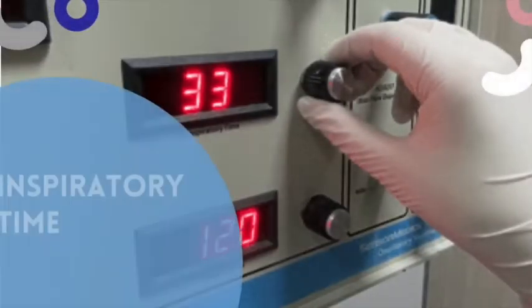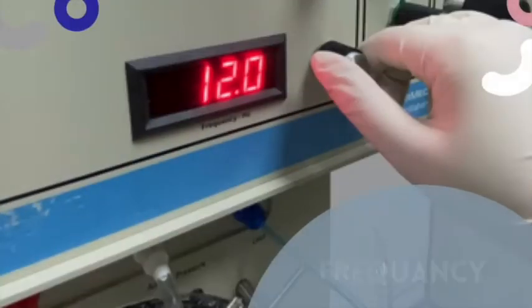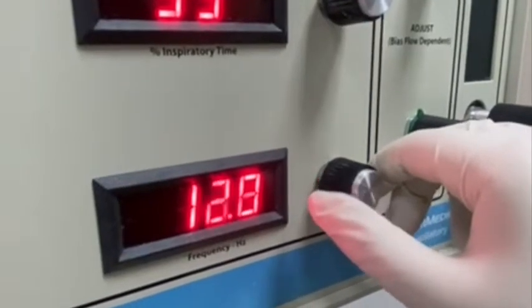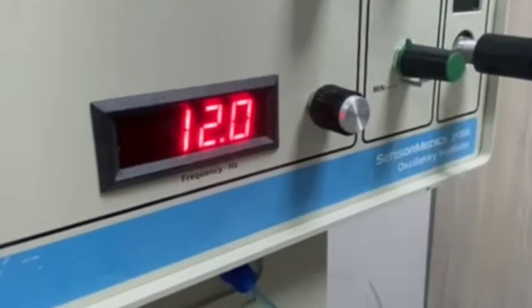Inspiratory time should always be 33%. Start on 1 to 2, which is comparable to 33% in a SensorMedics. Frequency: to set the rate of oscillation for the patient, the fast rates of high frequency oscillatory ventilation are created by a piston that pushes and pulls air, simulating small inspiration and expiration. These positive and negative pressure swings in a cycle are measured in hertz, where 1 hertz is equal to 60 breaths per minute.